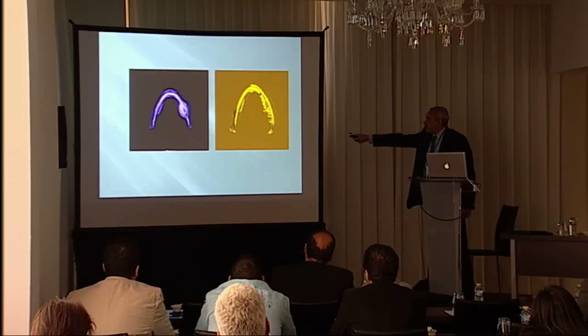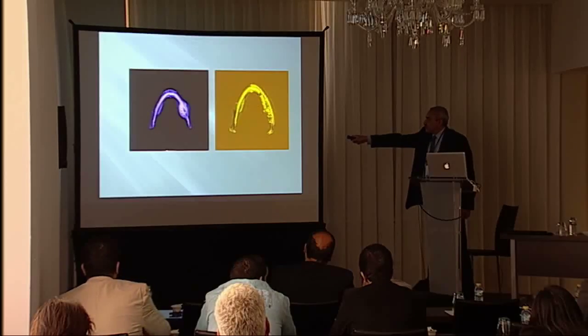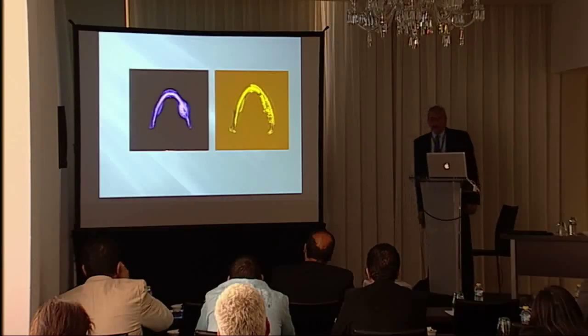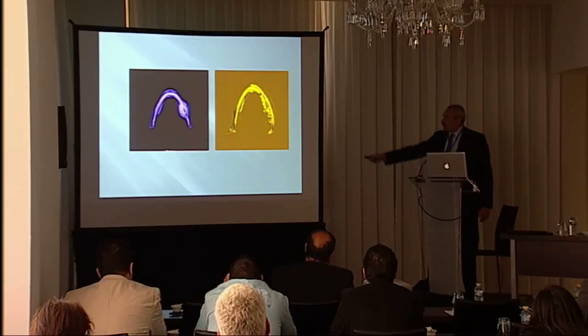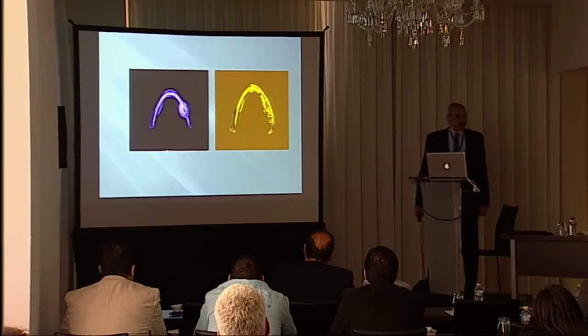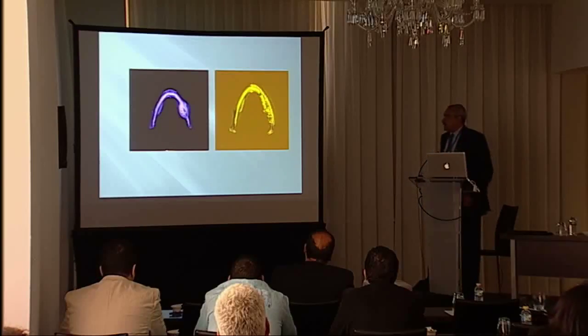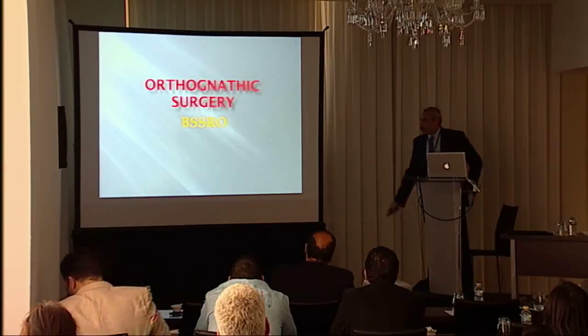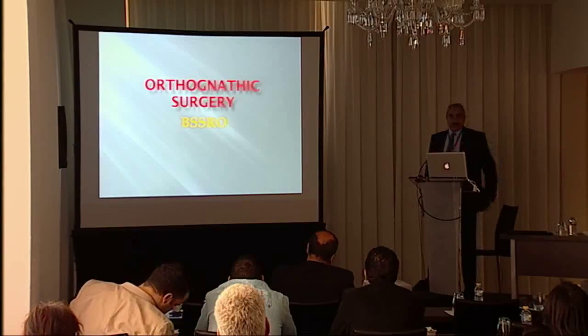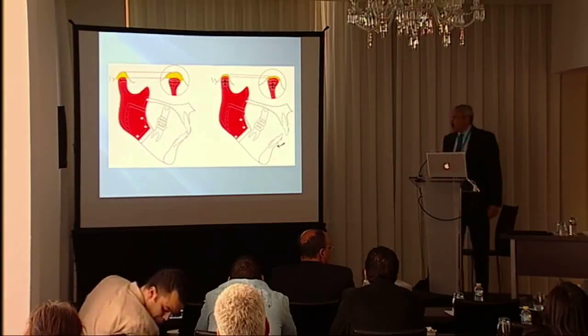And when you take from the inside of the reconstruction plate to the outside of the mandible, and you draw a vertical line and measure, you would be surprised that you can have 83 millimeters here and 84 millimeters to the other side, and the symmetry is outstanding, actually. So, in another use for orthognathic surgery, we start with the bilateral sagittal split osteotomy.